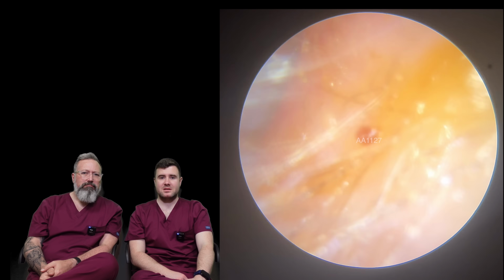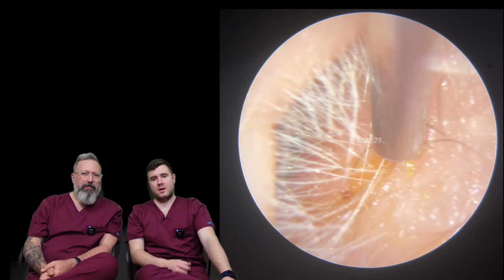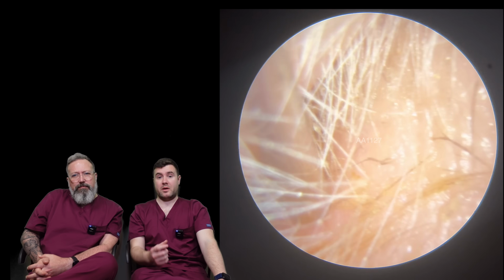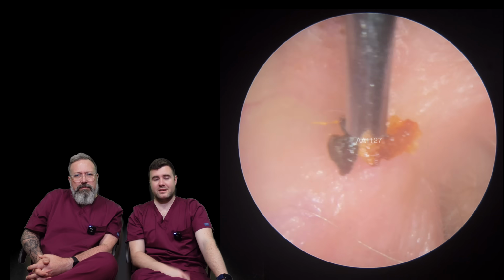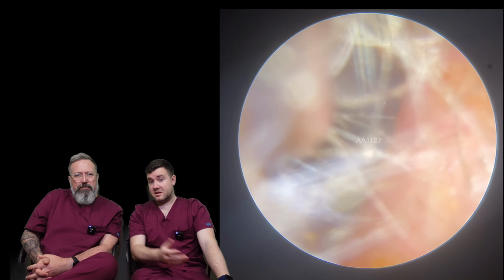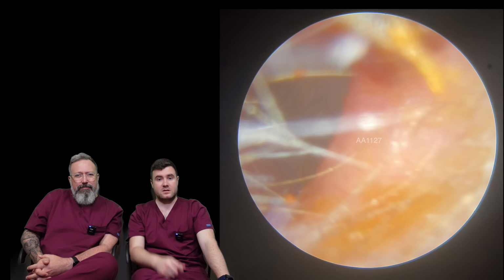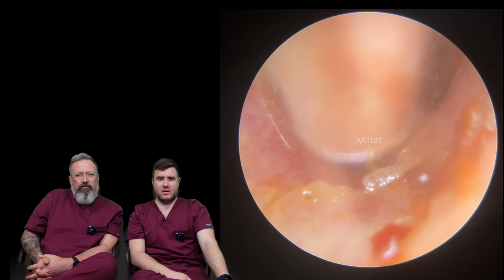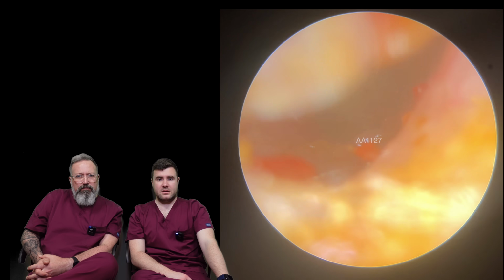Oh, there we are. It's coming out nice and easy. You've got a couple of little bits left here and there. It's quite a dry wax, so I was surprised that we managed to get a suction grip on those little bits, and those big bits that we've removed already. That's going to obstruct a little bit of our view, especially at the entrance. So I think we've swapped over to the fine end now, just to clean up these last little bits.